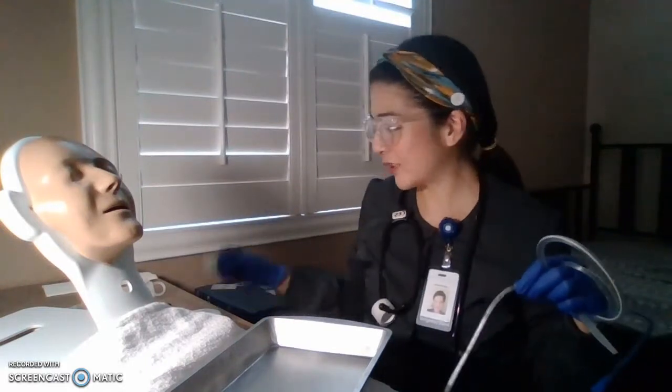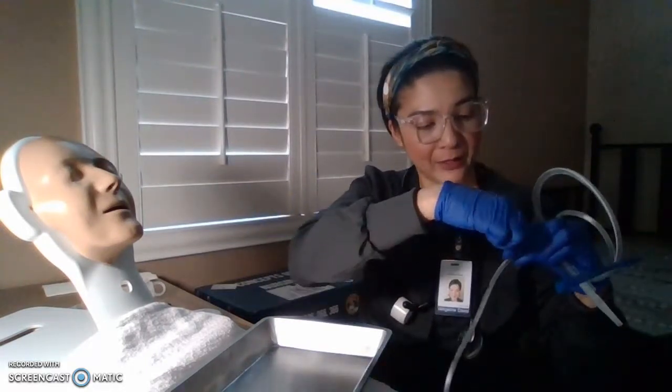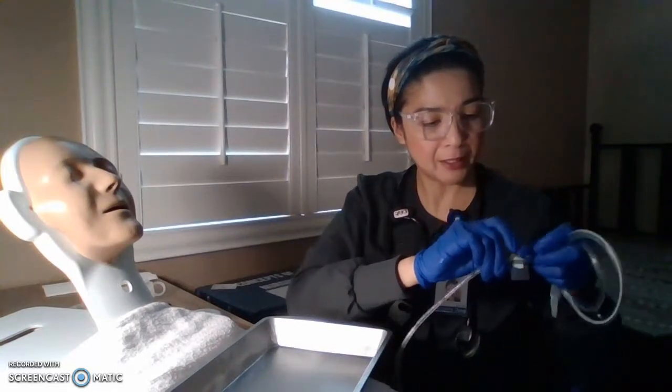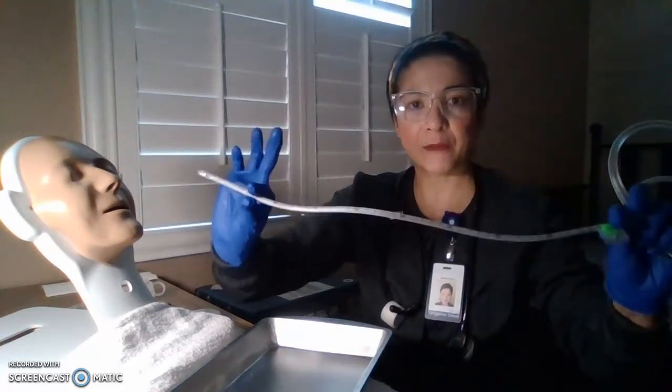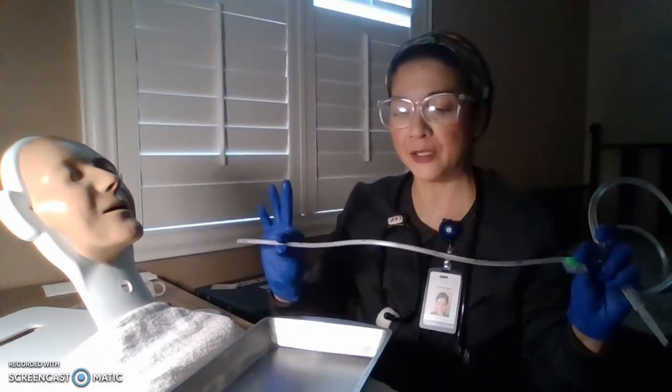So what I do, I use tape, right? And I'll mark it like so on 45. Right, so this is how much is going into the patient, right?